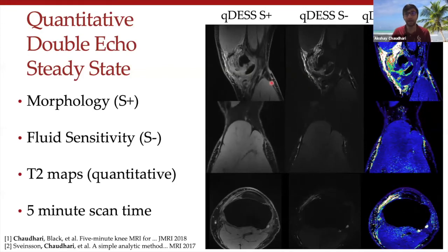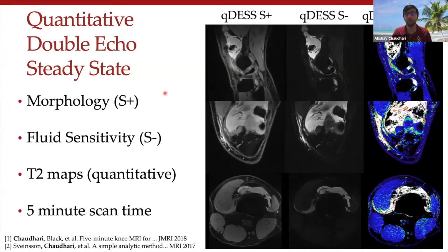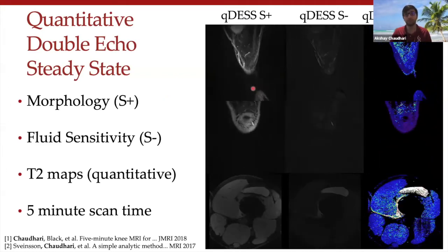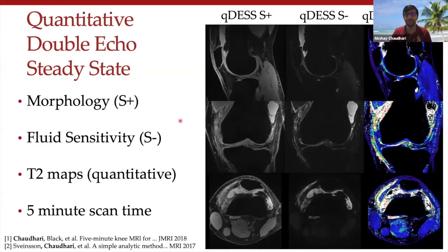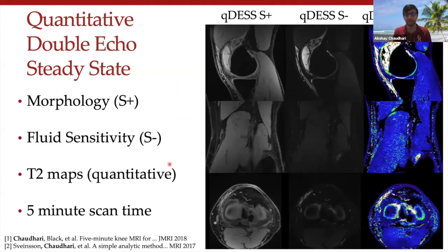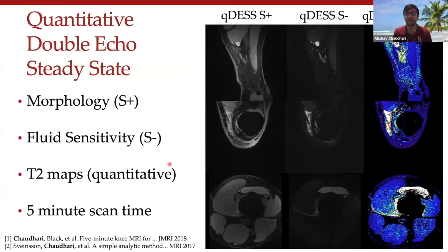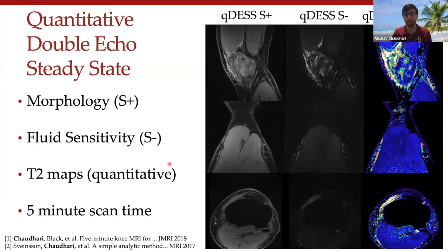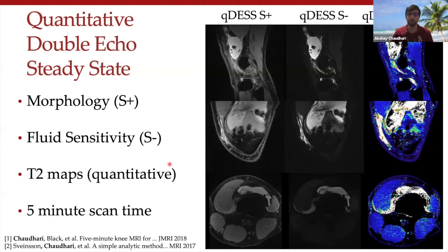Since we have high resolution to start off with, we can acquire in one particular imaging plane, and then reformat our scans accordingly to different planes, so that we can study the whole joint from multiple different angles and really understand what whole joint changes occur in disease activity.